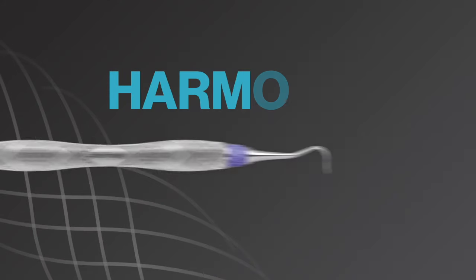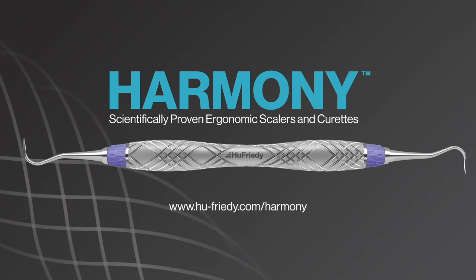Relief for your hands, down to a science. Harmony Ergonomic Scalers and Curettes.